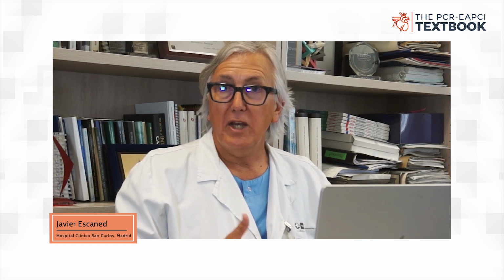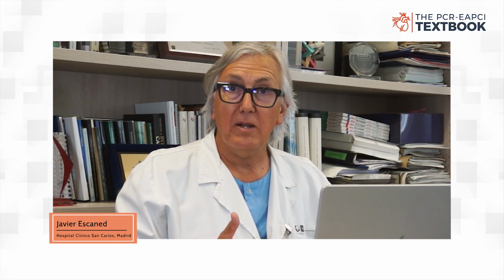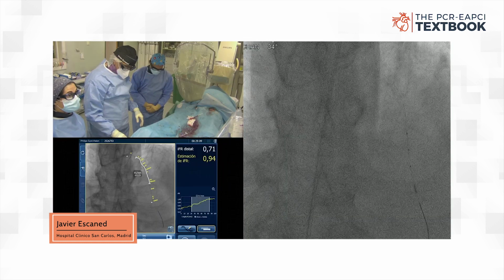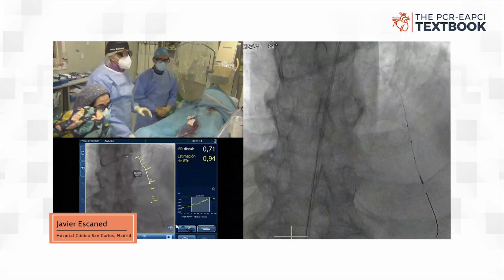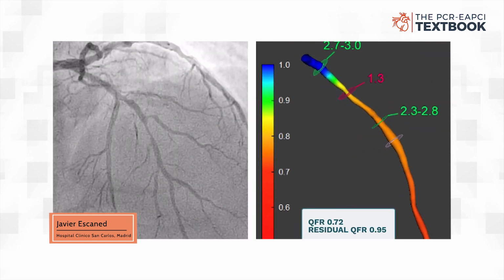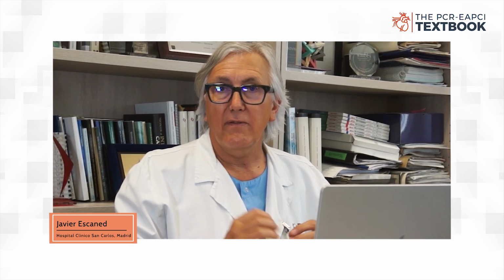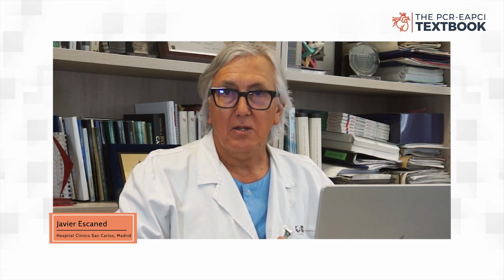You will learn multiple tricks that can be performed in your cath lab using what is already available, but also you will learn about the use of more sophisticated approaches, like, for example, co-registration of IVUS with the wire silhouette without performing injections, use of pre-existing material like previous angiograms or CT angiograms that can be analyzed to prepare your case, or also the use of diluted contrast to perform selective injections while reducing the total amount of iodinated contrast administered to the patient.